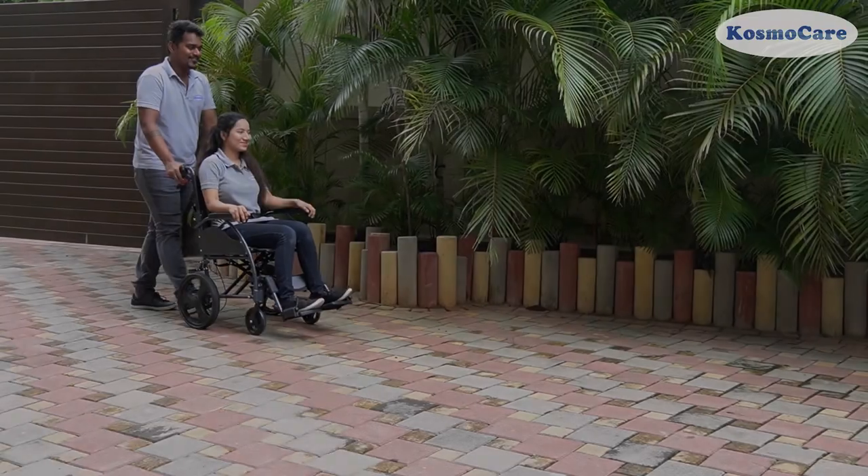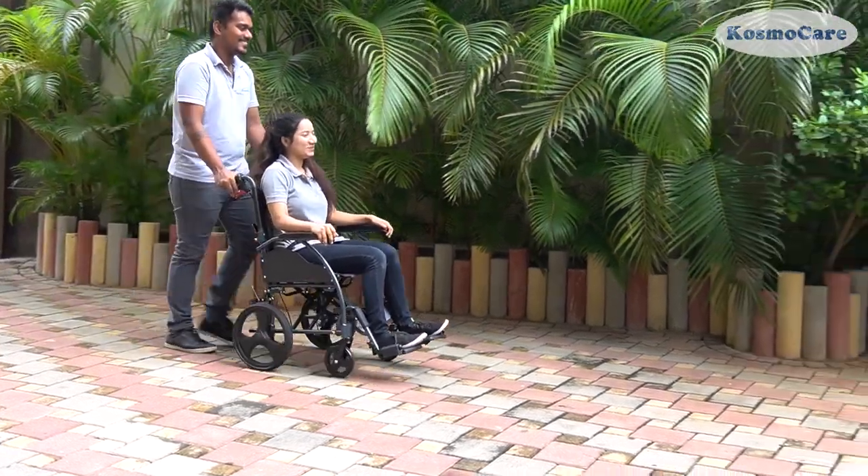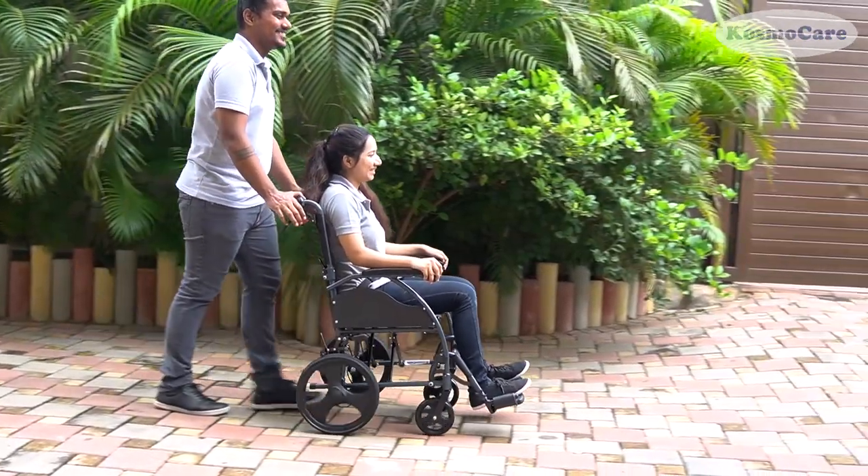Give your loved ones the convenience and freedom they deserve, with the Stylex Crest Series Wheelchair from Cosmo Care.